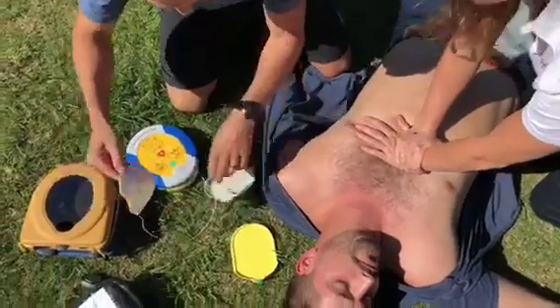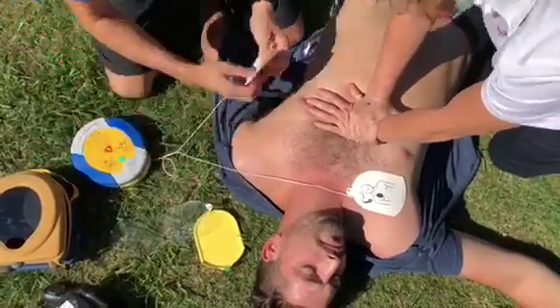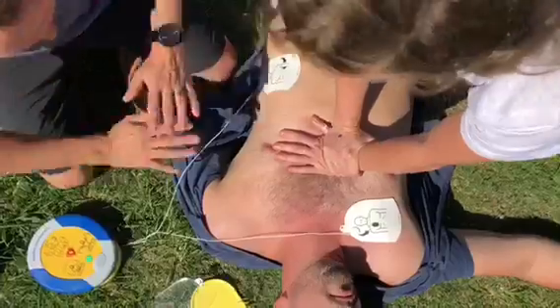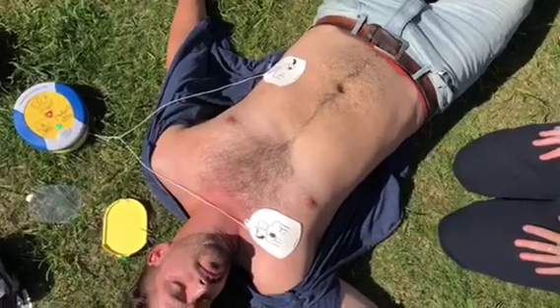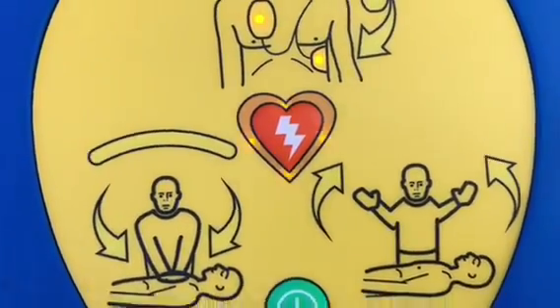Peel pads from liner. Remove any excess hair from the patient where the pads are placed with a surgical razor that's also in the prep kit. Assessing heart rhythm. Do not touch the patient. Shock advised. Stand clear of patient. Press the orange shock button now.